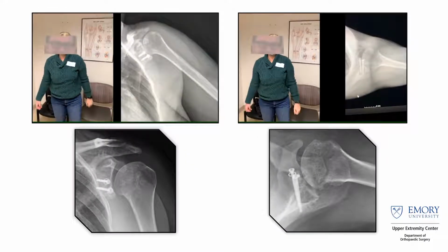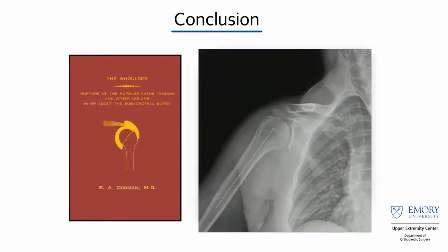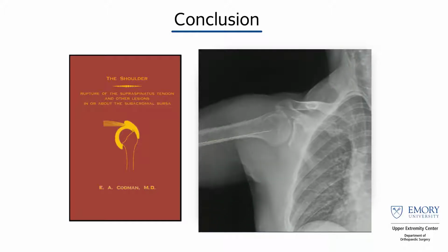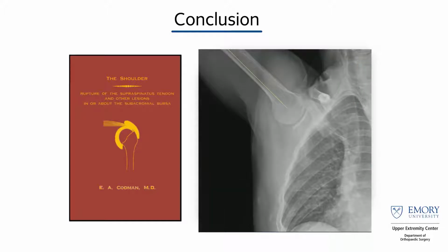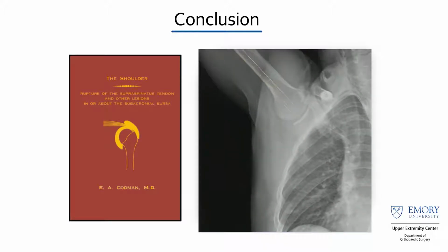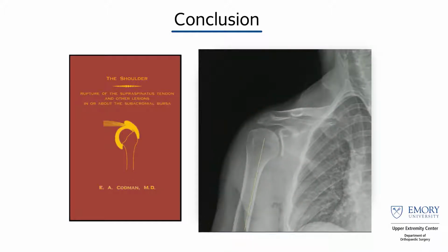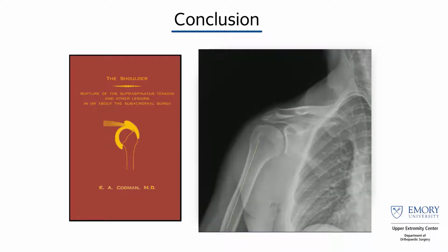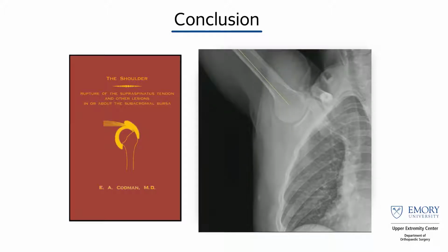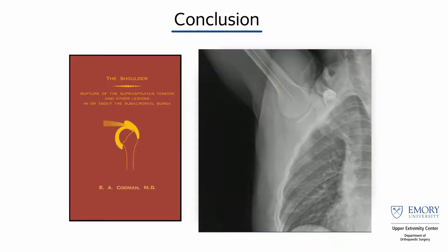So in conclusion, the reason why I like this technology and the reason why I get quite excited when thinking about its future is it really gives you some cool insight into what's going on besides what you sort of try to interpret based off some static views. It's like looking at a picture versus looking at a video. You get so much more information from a video. They say a picture's worth 1,000 words, but a video is worth 1,000 pictures. I mean, you get so much more off these videos.